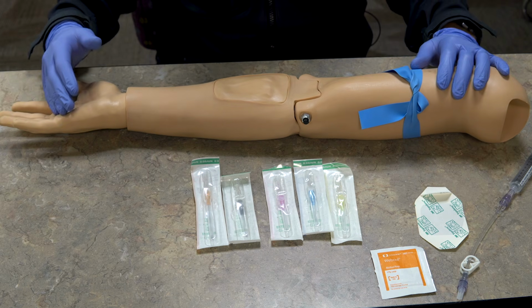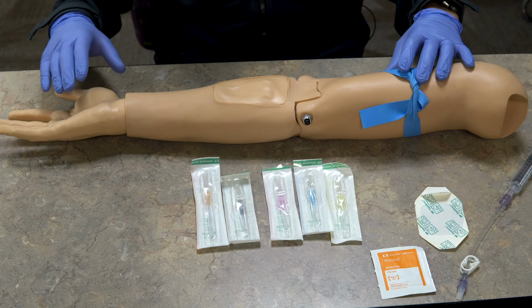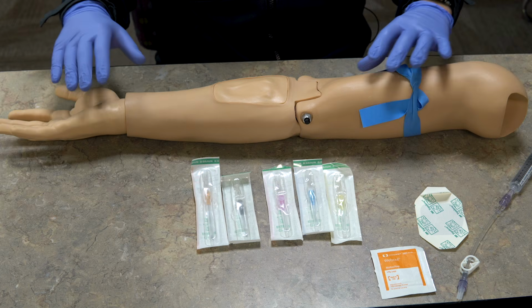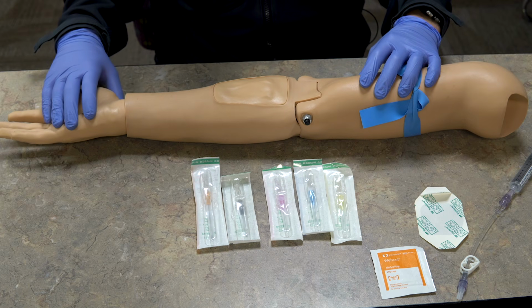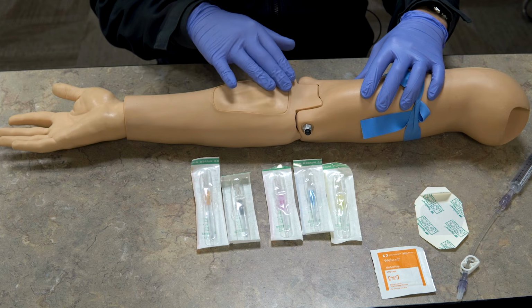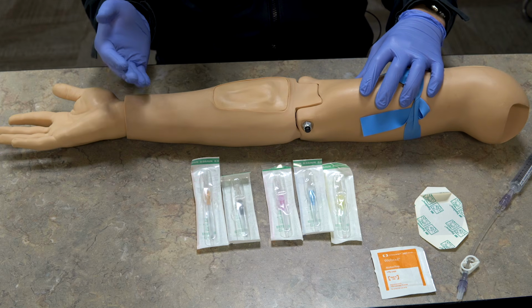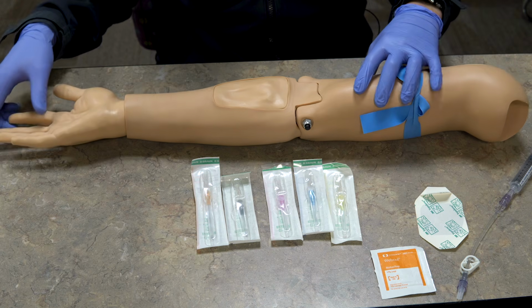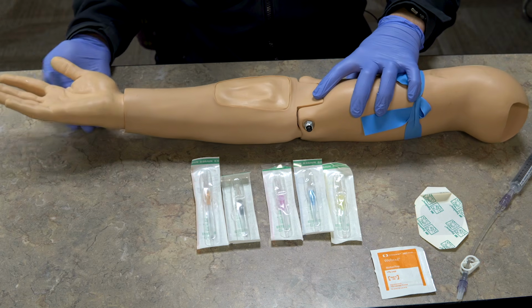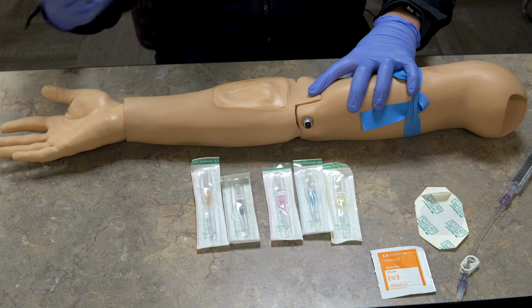So then you want to select your site, and selecting your site is one of the hardest things to do, and it's something that comes with a lot of experience. So you can go literally anywhere on the arm. Generally speaking, your AC joint here is going to be the most obvious, that usually has the biggest veins. You don't always want to go for those in an emergency setting. Sometimes they're the easiest, but if the patient's going to be having this IV for a long period of time, every time they bend their arm, it might cut off that blood flow, so you might not want to start there.